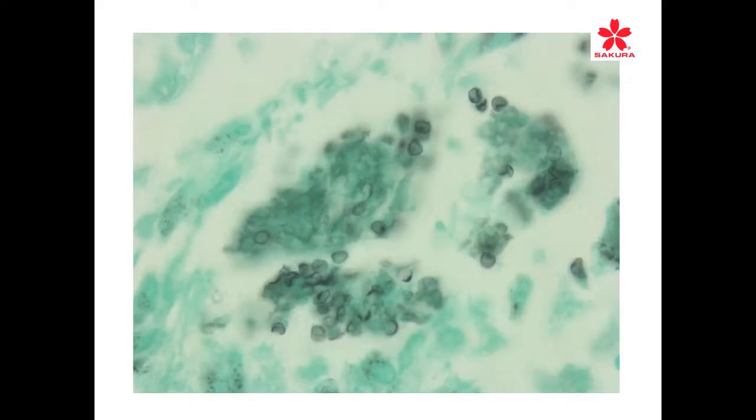So this takes us on to another type of microorganism. This organism here, you can see is much different from the Aspergillus. And this is pneumocystis. And this is the opportunistic infection that we mainly see in HIV patients. But anyone basically who has developed pneumonia, this is the type of organism that you see in their lungs most often. This is a section of sputum.